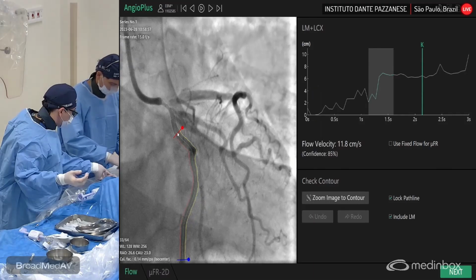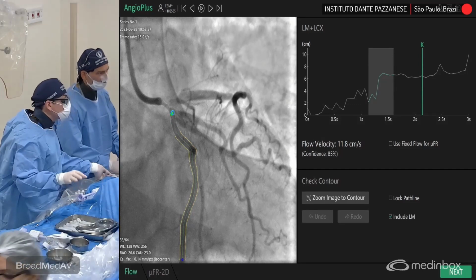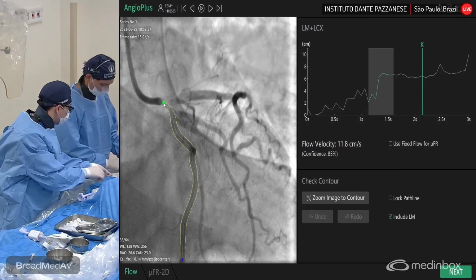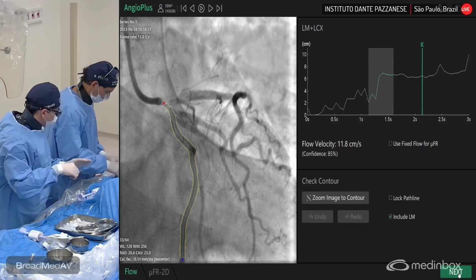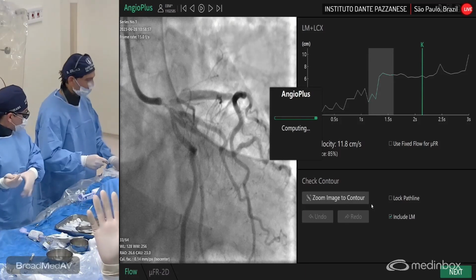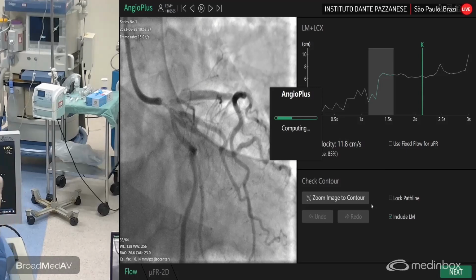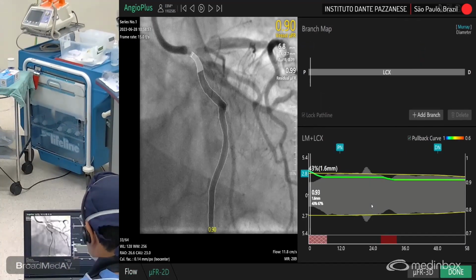Okay, so Louis, you're selecting here. That's a pre, right? Yes, the pre I'm doing again. Yeah, so maybe I could have the image here in the computer, the station that we're doing here, the FFR analysis. Can you show us here the camera? Okay, here we go. Very good.